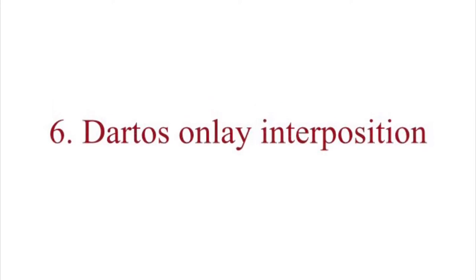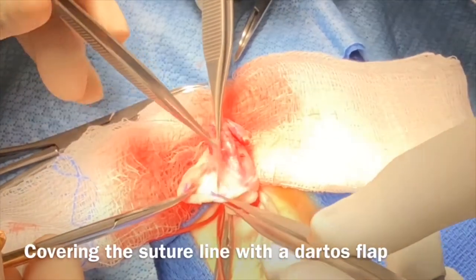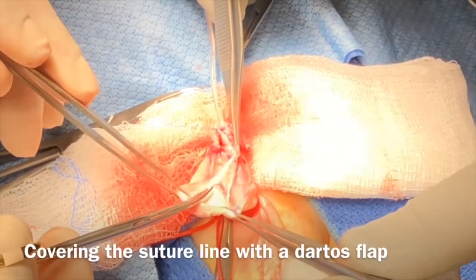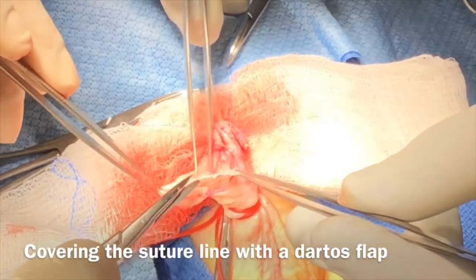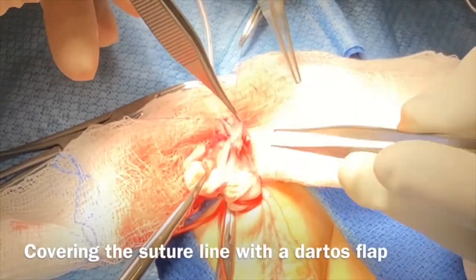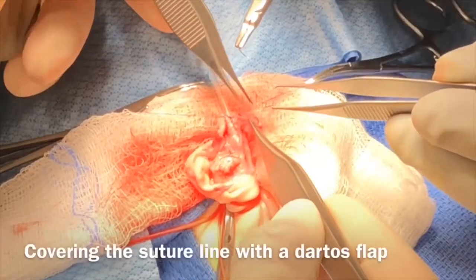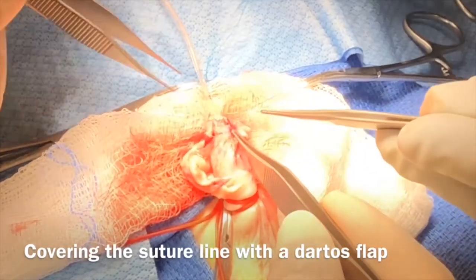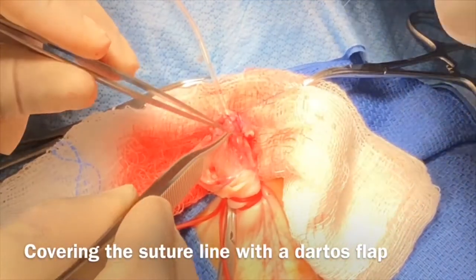The dartos layer is mobilized from the lateral aspect of the phallus from the foreskin, either right or left side. It is not necessary to go to the dorsal aspect for mobilizing this dartos flap. The vascularized dartos flap is secured lateral to the neo-urethra at the tip to the underlying corporal tissue. The material used is 6-0 PDS.